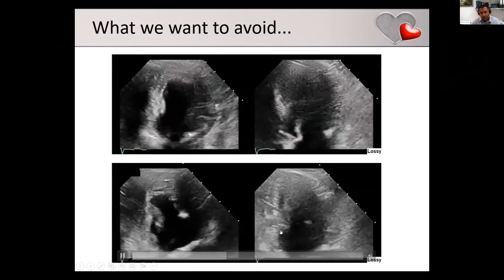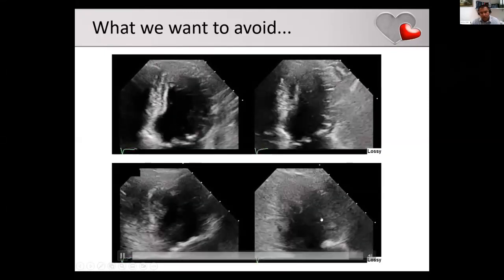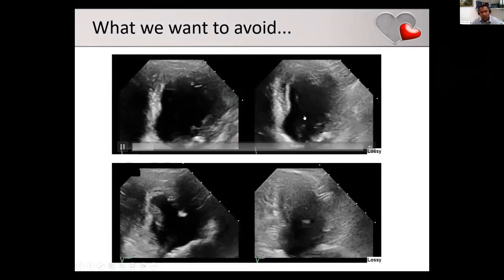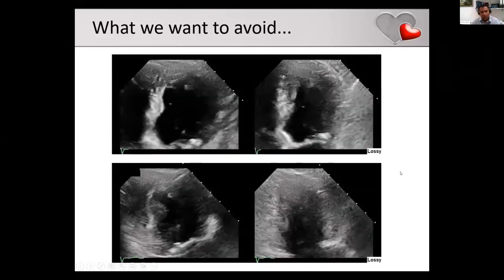The person is alive. Beyond that, I would be very hesitant just to call ischemia or no ischemia. But this is someone that's obviously just tried to cope. And what we're trying to say is don't do that. Take the time to give contrast and maximize your image quality.